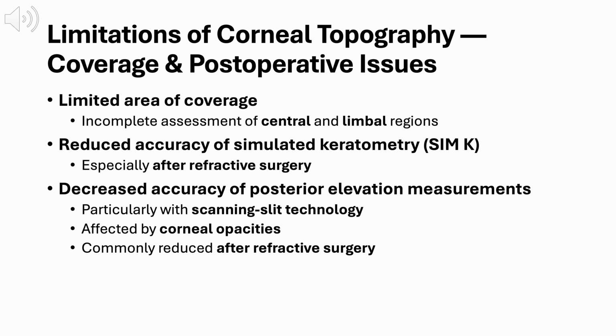This slide highlights additional limitations of corneal topography related to coverage and postoperative changes. First, corneal topography has a limited area of coverage. It does not fully assess the very central cornea or the far peripheral and limbal regions, which means important information can be missed in those areas. Simulated keratometry, or SIM-K, also becomes less reliable, especially after refractive surgery. Because SIM-K is derived from assumptions about anterior corneal curvature, surgical alteration of the cornea can significantly reduce its accuracy.